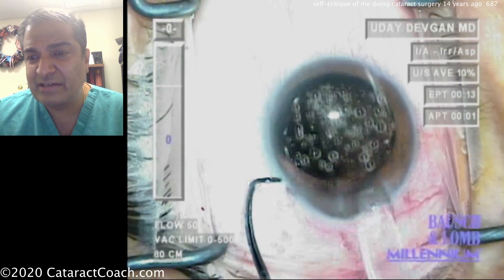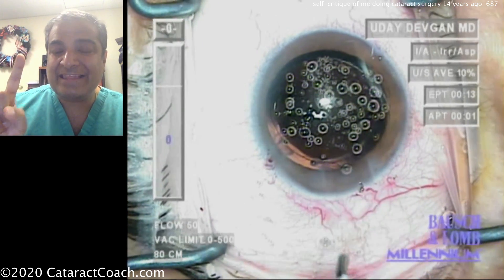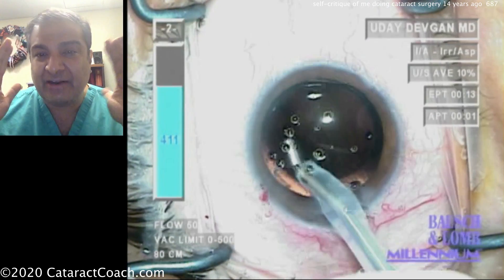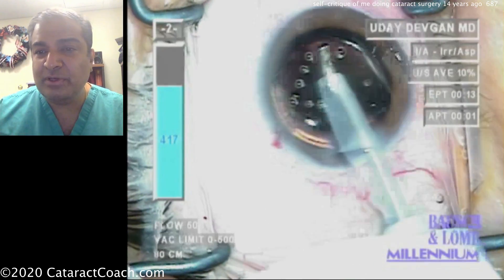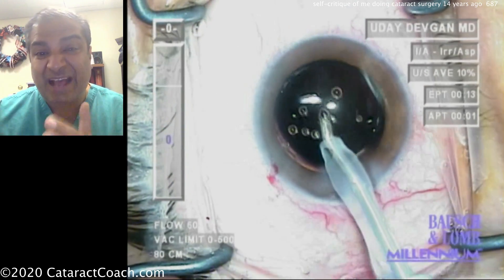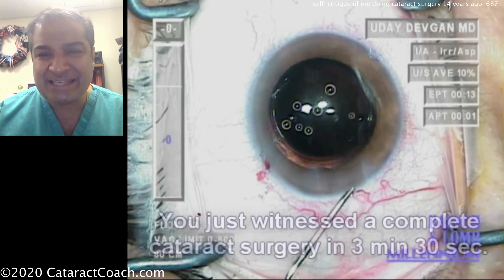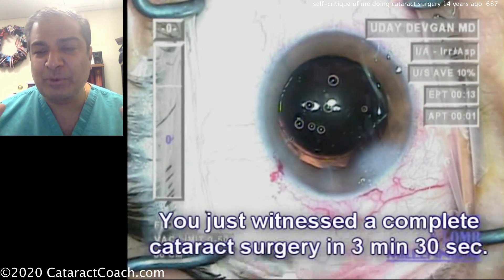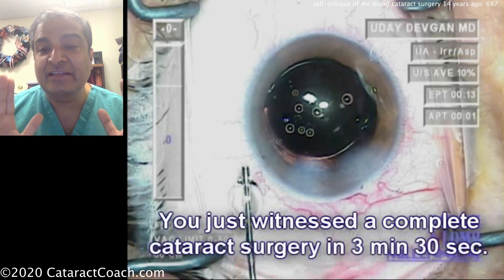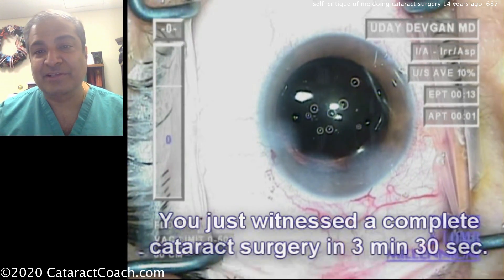Even now, 14 years later, this stands up as a pretty good case. But there's one thing we ought to definitely change, and that's the surgeon mentality and focus. I was 15 years ago more concerned with being a quicker or faster surgeon — and we don't like that. Speed is not important. It's much more important to be a good, safe, clean, meticulous surgeon. Certainly be efficient, but speed is not part of the equation.